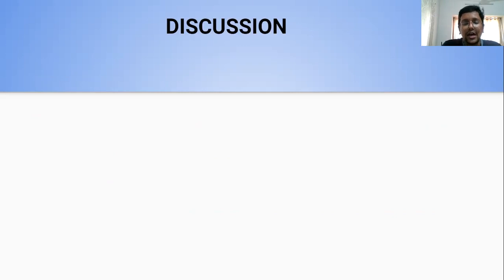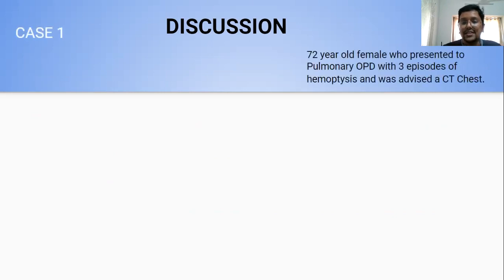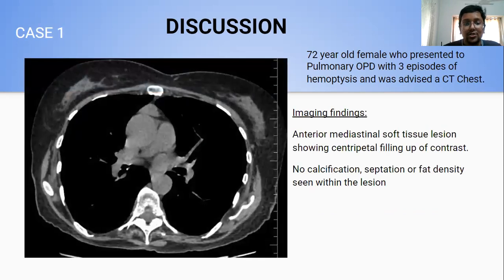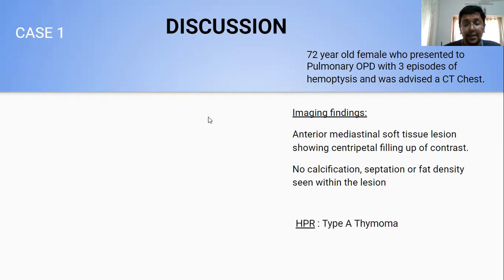My first case was a 72-year-old female who presented to the pulmonary OPD with three episodes of haemoptysis and was advised a CT chest. Imaging showed on plain axial section a well-defined soft tissue density lesion involving the anterior mediastinum with no evidence of loss of fat planes with the adjacent vasculature. There was no significant mediastinal lymphadenopathy. Post-contrast images revealed enhancement with centripetal filling, and there was no evidence of any bony erosions. This turned out to be a type A thymoma.